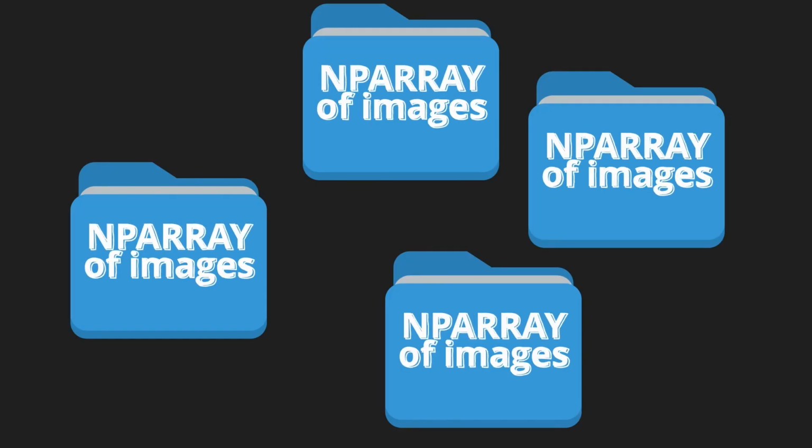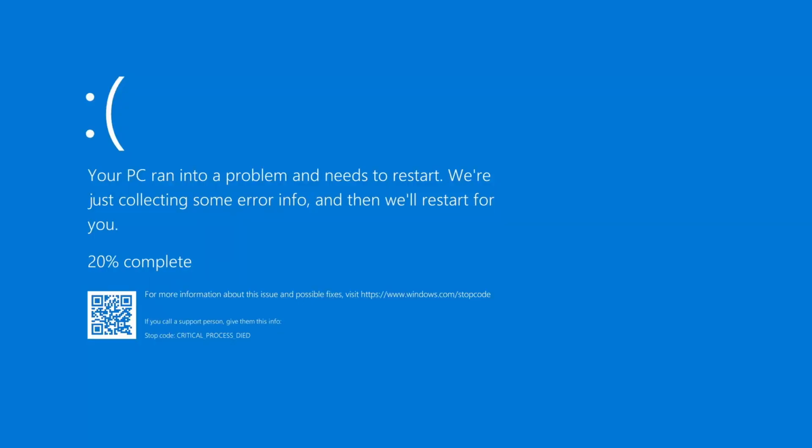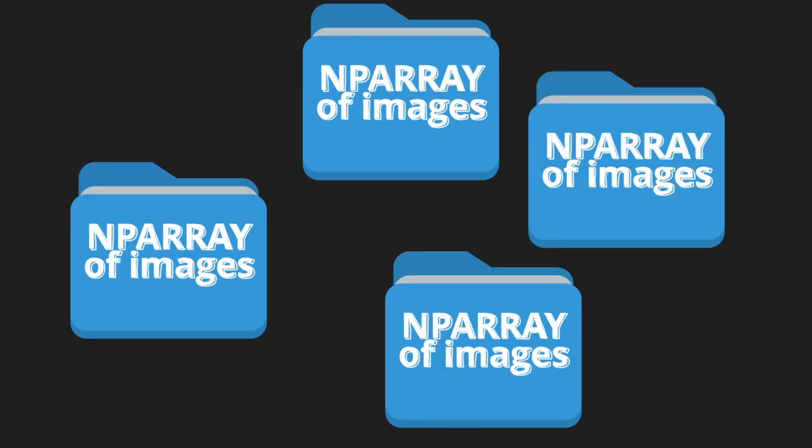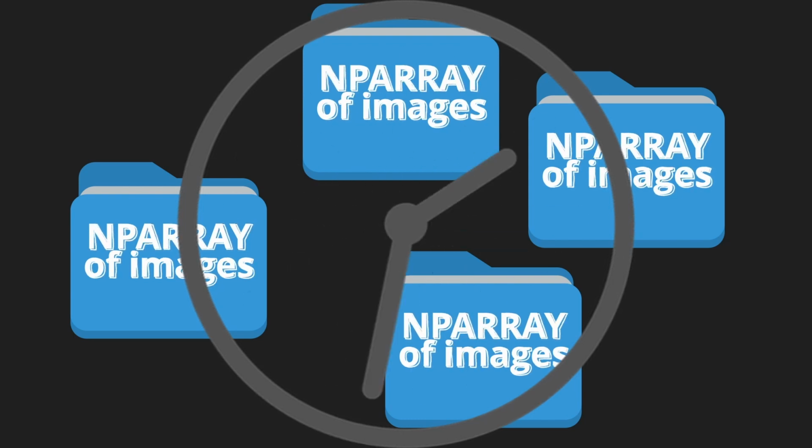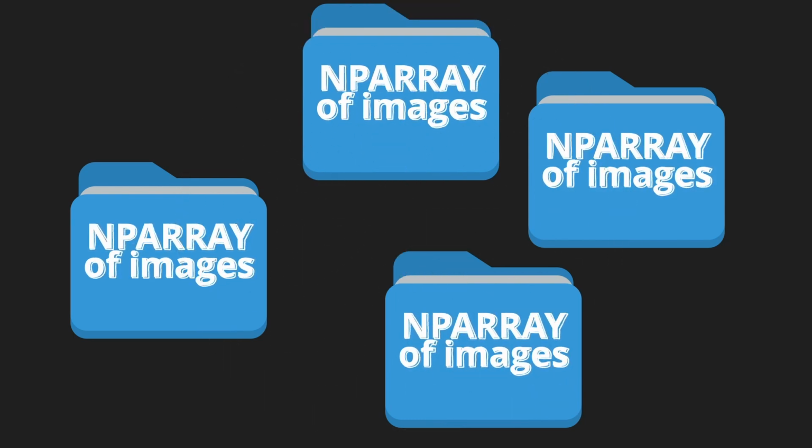The problem with this idea is that we'll have so many x-rays in each batch to process during the modeling phase that we'll either run out of memory before we even run the model, or it will take so long to load the images that it won't be practical to run multiple batches of images through the model.